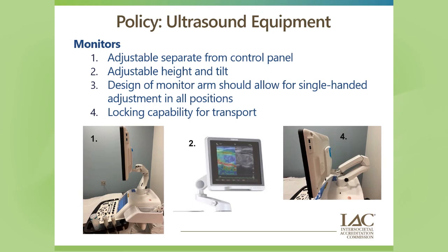The design of this monitor arm should allow for single-handed adjustments in all positions. So meaning that you're not having to use both hands to move it, that you can keep, if you want to, your hand on the patient with the probe and move that monitor. So it shouldn't be a challenge to unlock or to move.